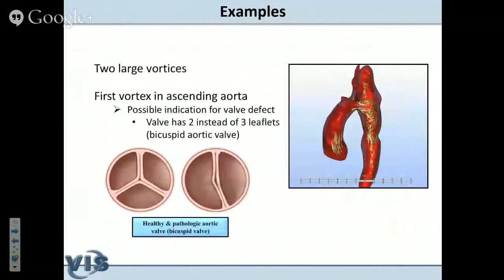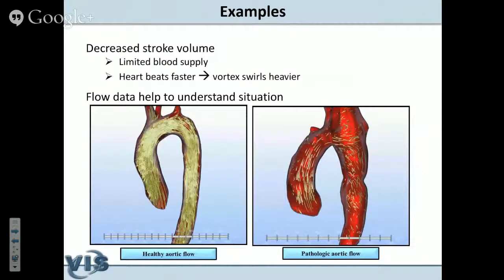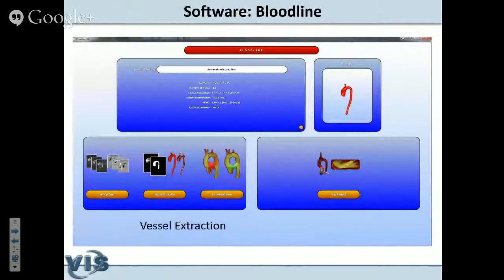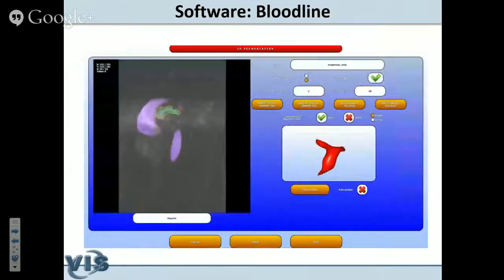The lambda 2 criterion was the best to extract these vortical patterns. One kind of pathology we looked at is a bicuspid valve — a healthy valve is a tricuspid valve with three parts, but in some patients with a congenital heart disease it only has two parts. It is really interesting to see how blood flow changes and whether surgery is necessary to correct this. All of this is integrated in a tool called Bloodline, which we have delivered to our three clinical partners so they can evaluate their own datasets.